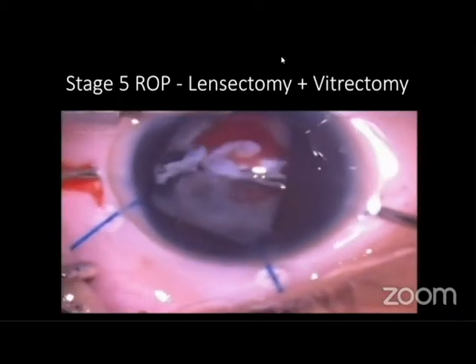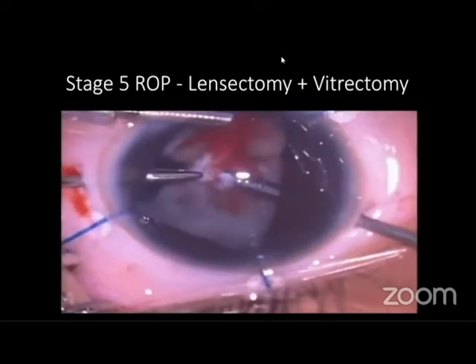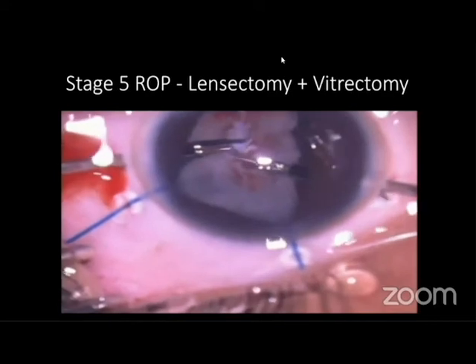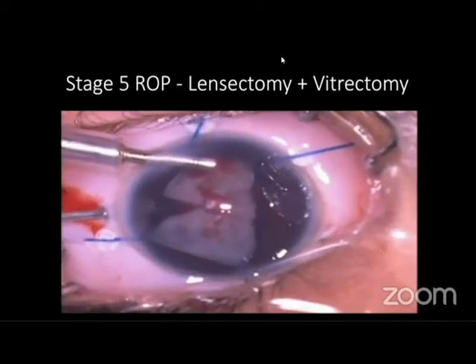without too much of a problem of creating a dialysis. As we progress posteriorly towards the disc, we may not be able to identify the disc, but we know where the proliferation extends from. So we can see the peripheral trough is open and the posterior TRD which is there will settle over time.